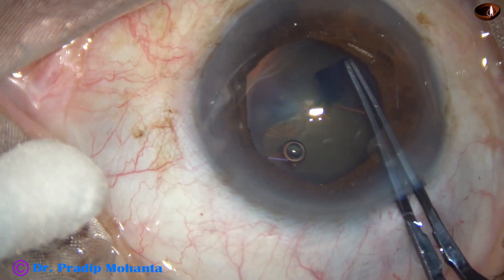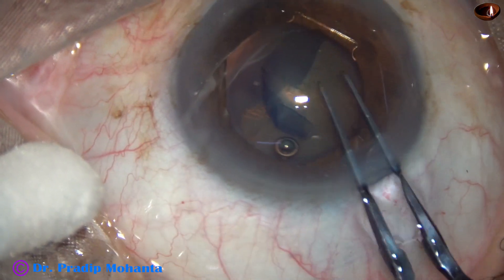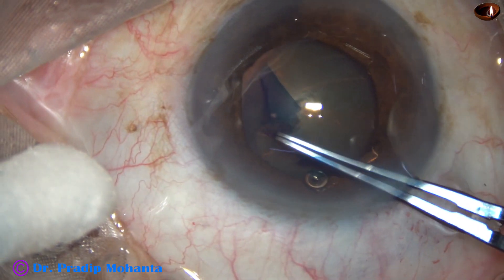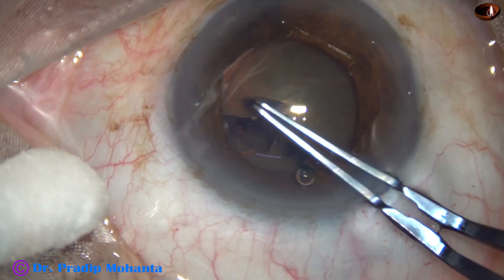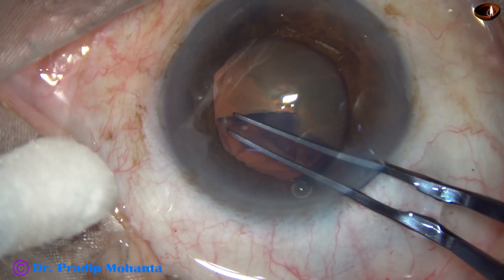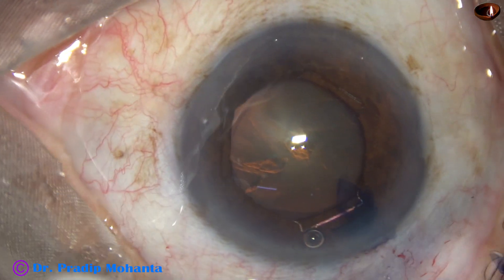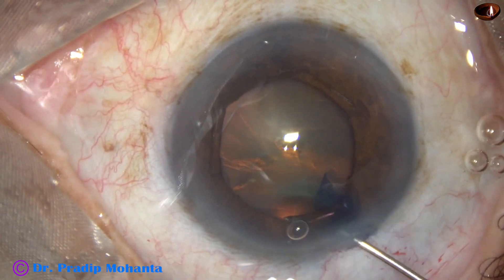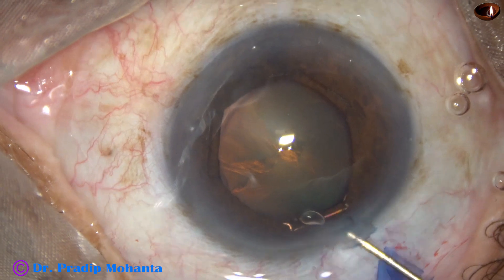The size of this rhexis is about 5.25 mm. In some areas, the rhexis goes beyond the dilated pupil, which is about 5 mm. So we have got an adequate sized rhexis.